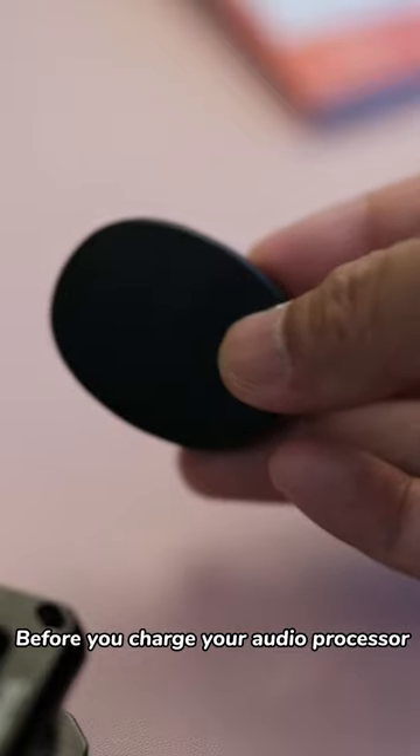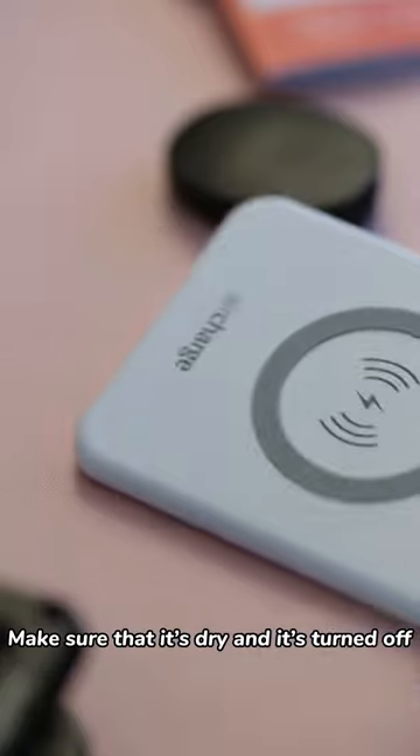Before you charge your audio processor, make sure that it's dry and it's turned off.